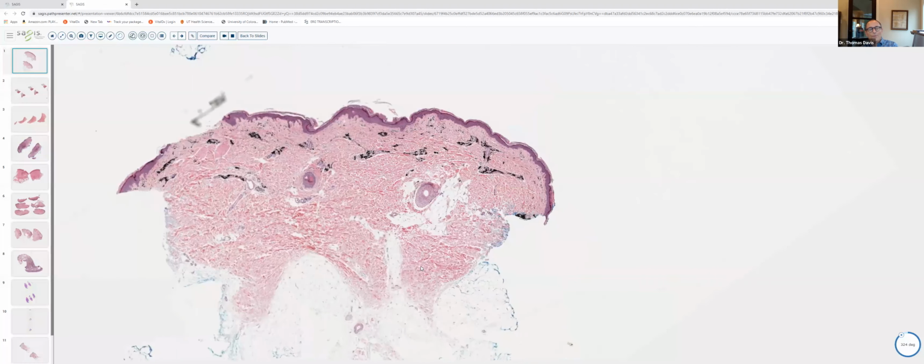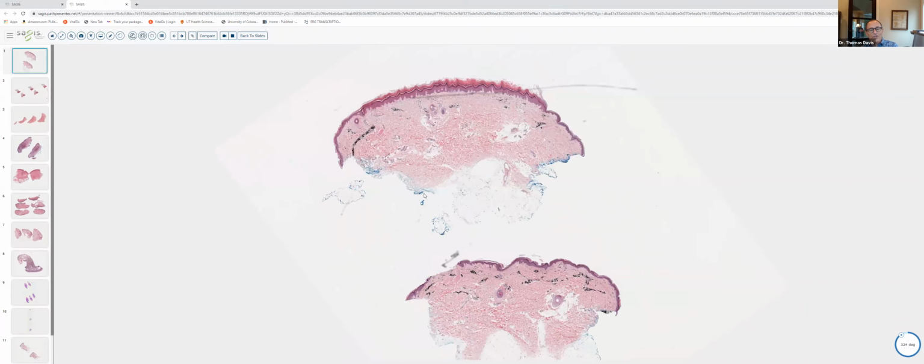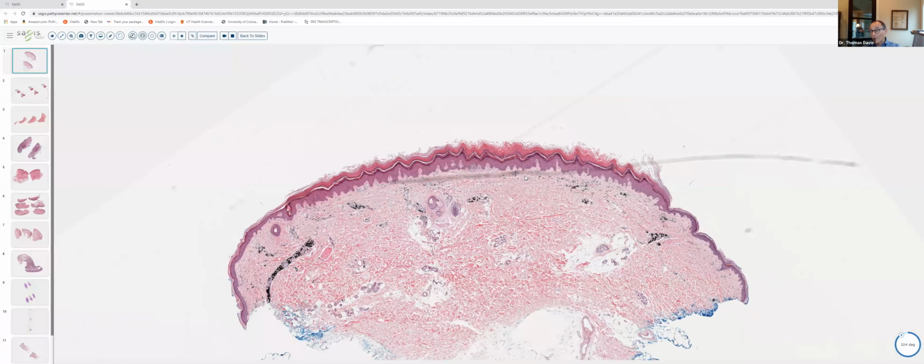With respect to anatomic location, we've got a relatively thin dermis and a fair amount of fat here, and a fairly low concentration of follicular and sebaceous elements. So the characteristics of the skin here would be compatible with more distal extremity. Notice too, as we zoom in a little bit, that the surface of the specimen is gently papillated, and we tend to see gentle papillations like that in our flexural surfaces, so elbow, knee, ankle sites such as that.